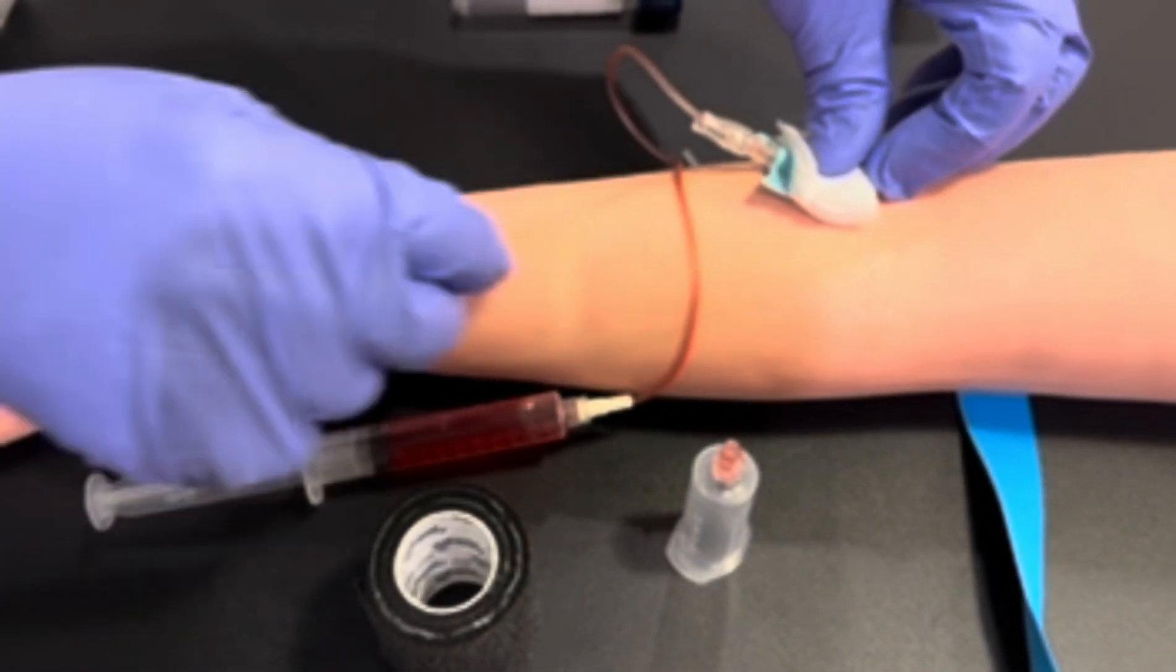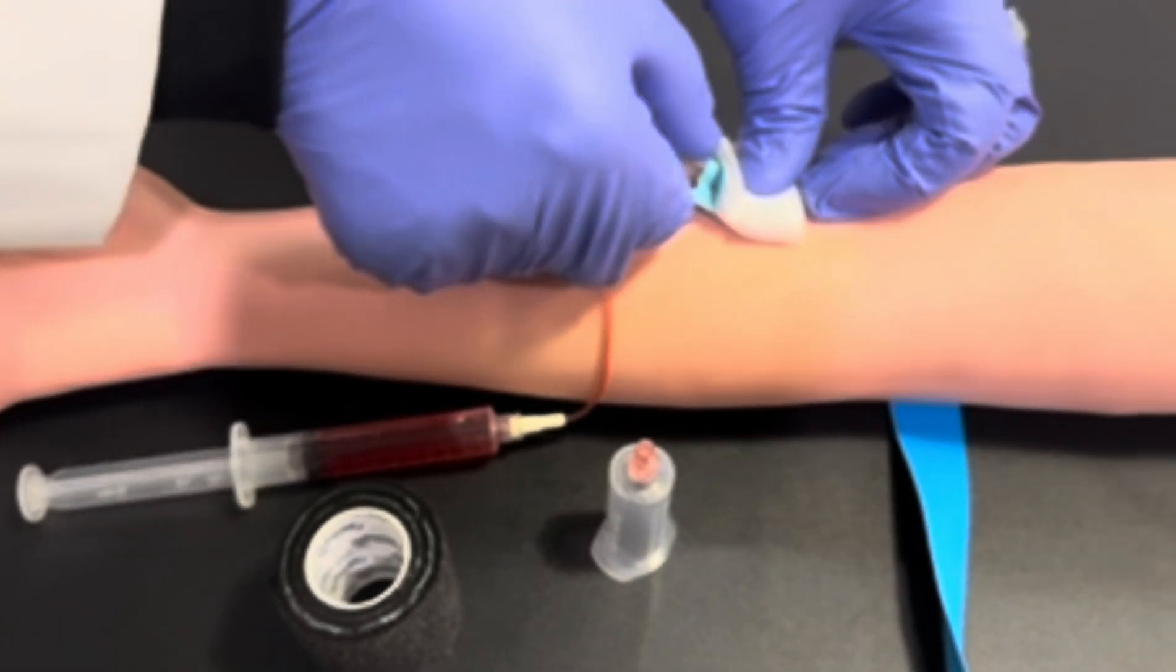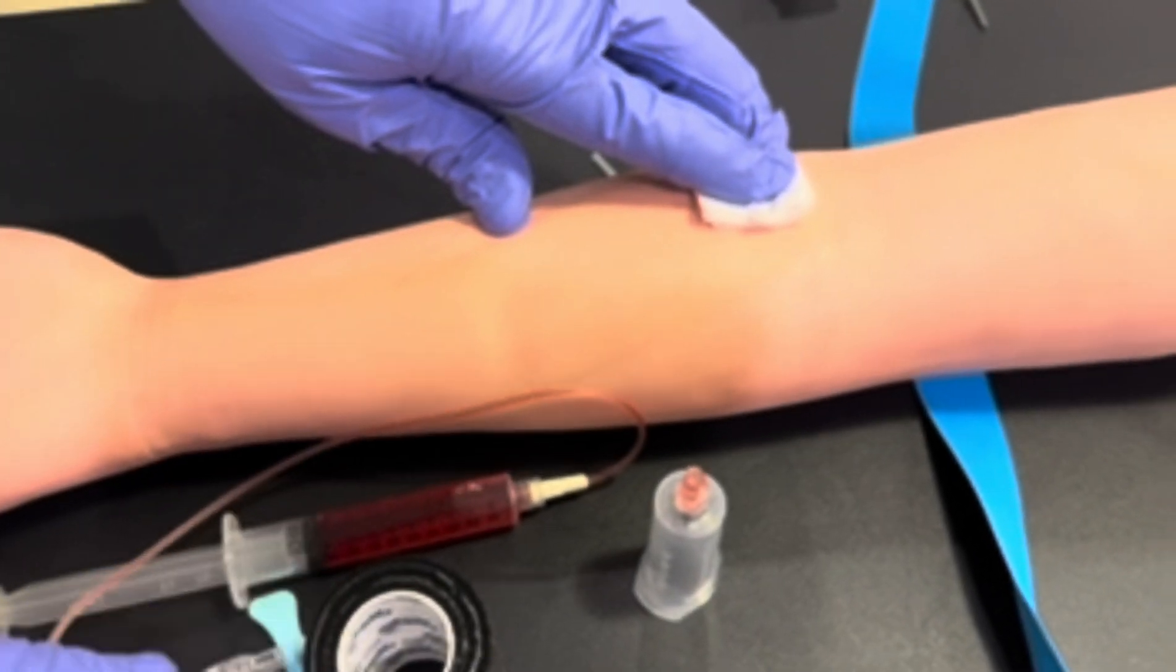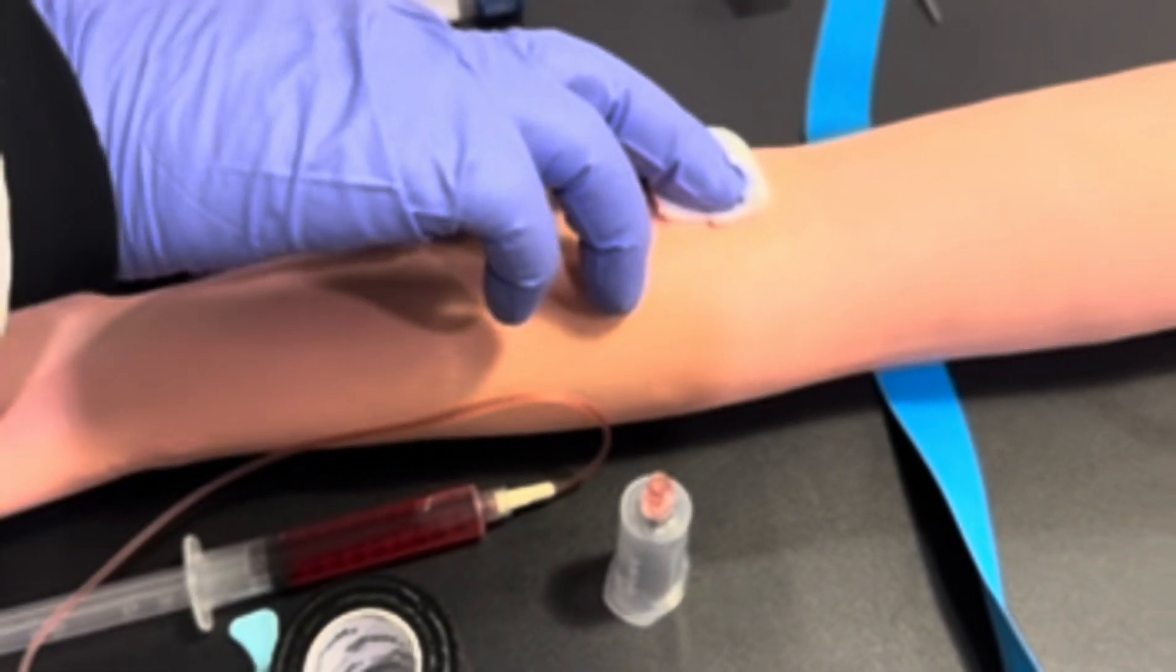Use your 2x2 gauze and retract the butterfly needle safely. Apply pressure to the site with the 2x2 gauze.